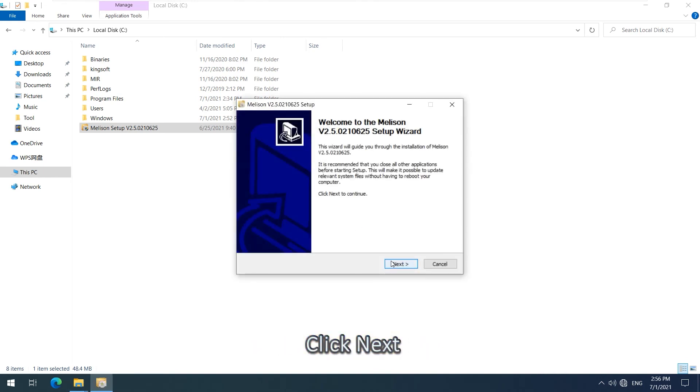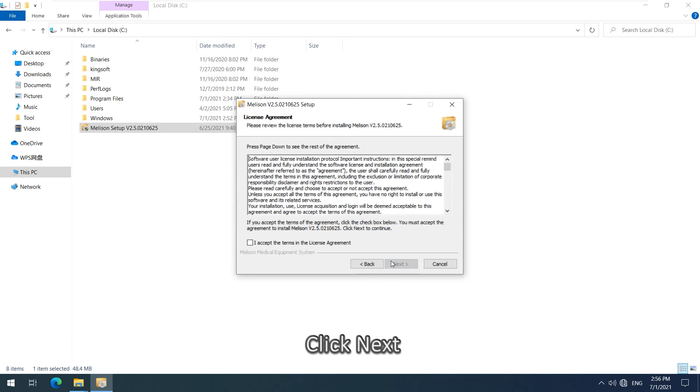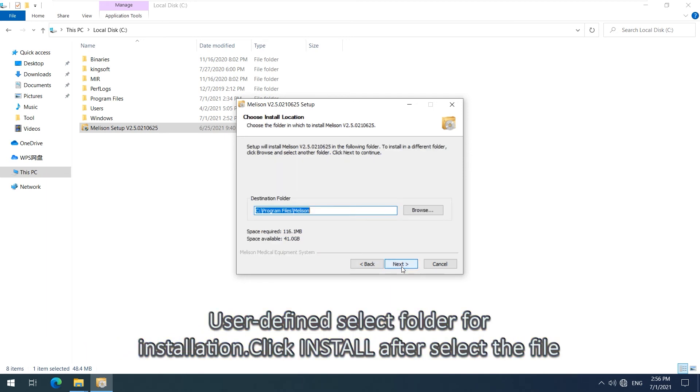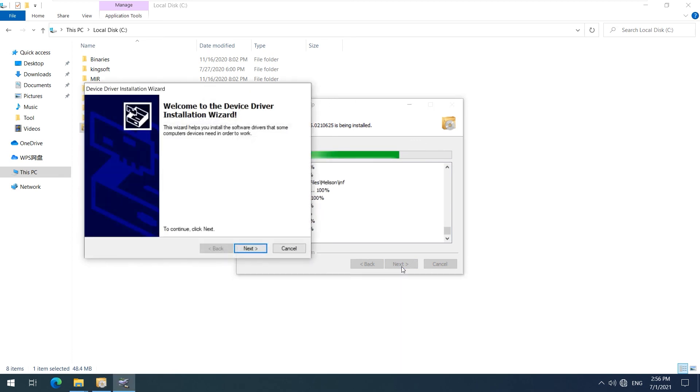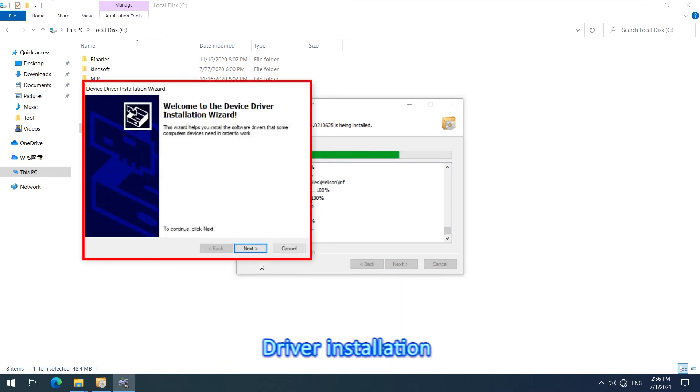Click Next, then tick to agree. For user-defined installation, select the folder for installation. Click Install after selecting the file. Driver installation will then proceed.